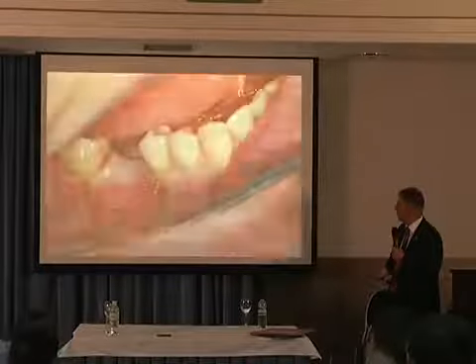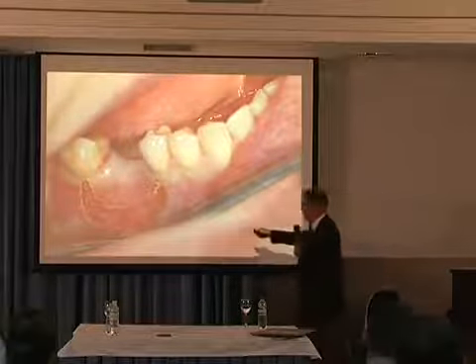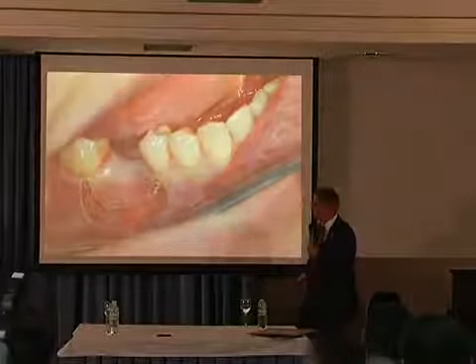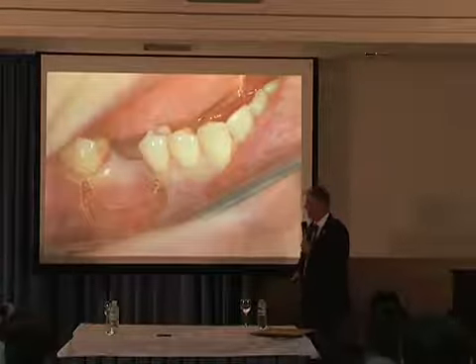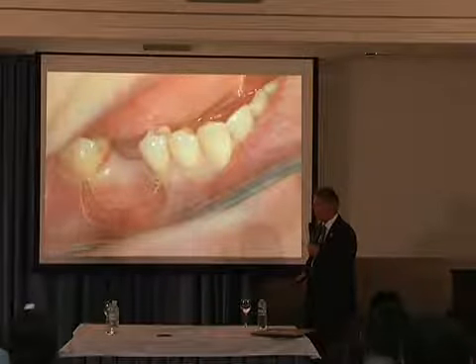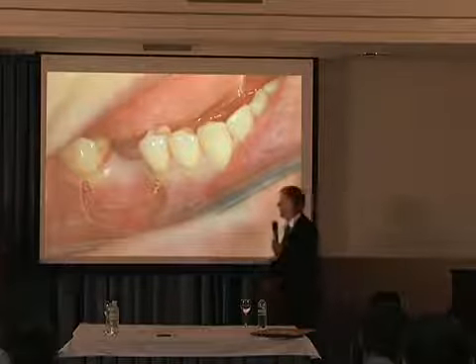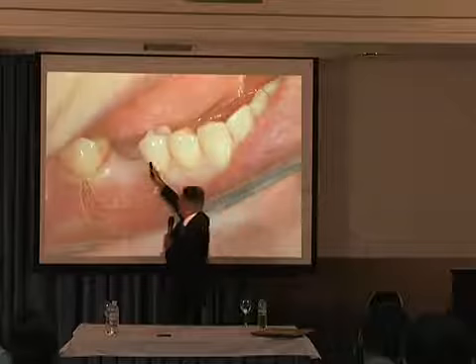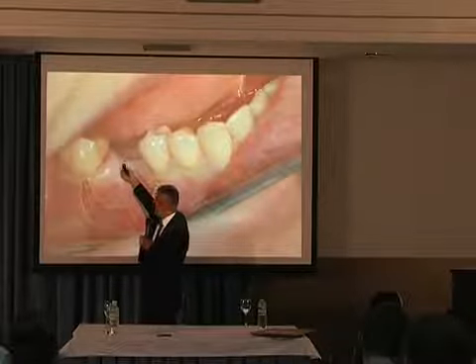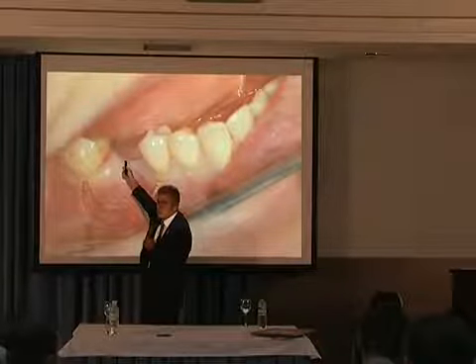4 mm bone splitting implantation, one stage. The first step to success is the soft tissue management here. И, естественно, когда вы приступаете к процедуре расщепления альвеолярного отростка, то самым важным моментом это является управление или забота, будем так говорить, о мягких тканях в зоне имплантации. If you deliver here a straight incision on the alveolar ridge and then go ahead with a bone splitting, your incision and your stitches are directly above the splitted area in the implant.